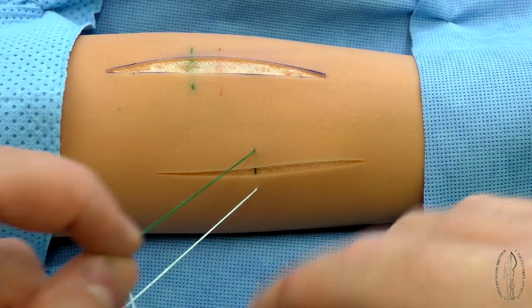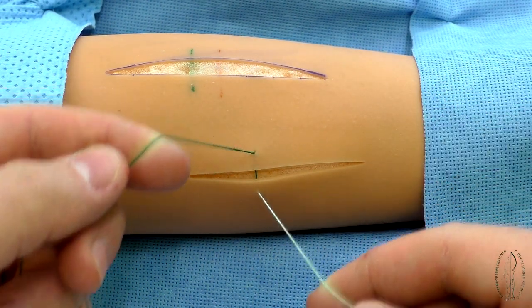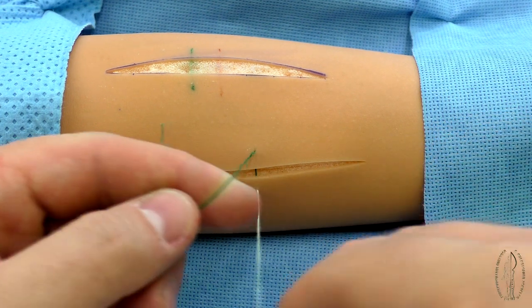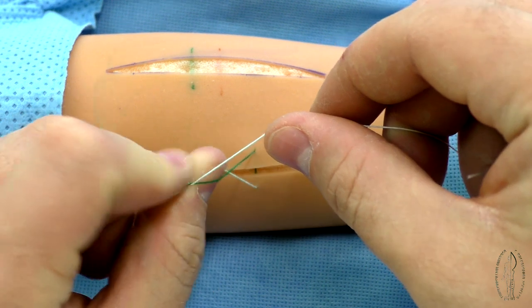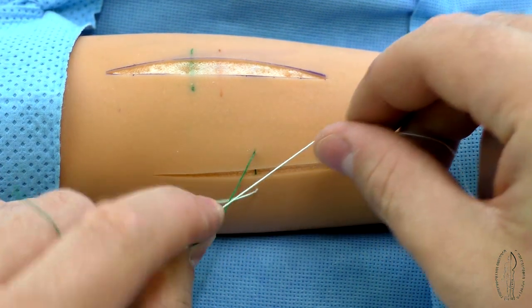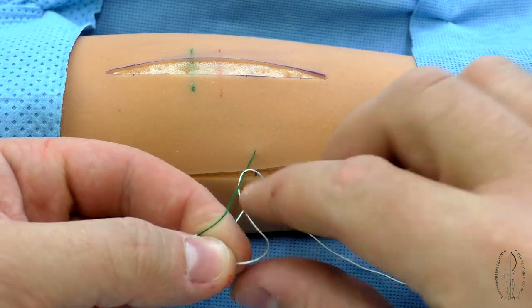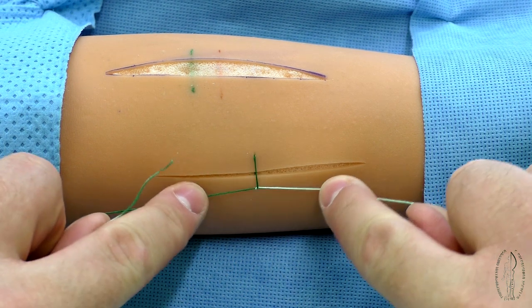In order to avoid it, the distant or stained filament should be in the left hand and the closest, that is, white one, in the right hand. Then the primary loop is formed. Both filaments are fixed by the big and index fingers. The white filament is brought by the right hand under the index fingertip of the left hand and the loop is formed.